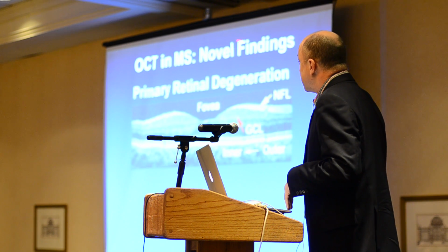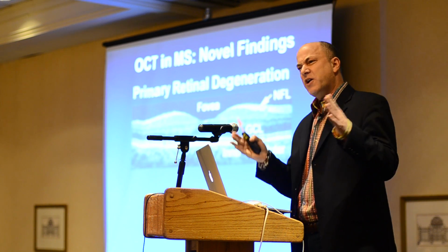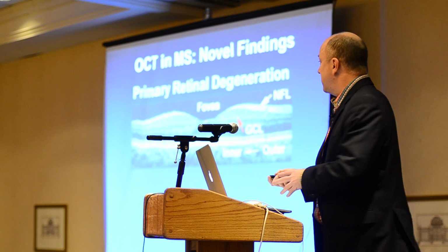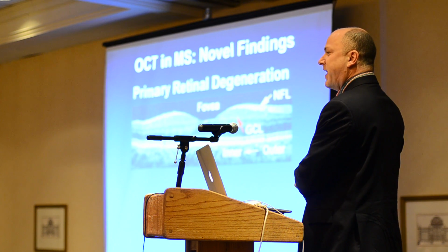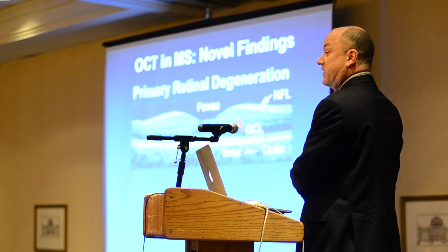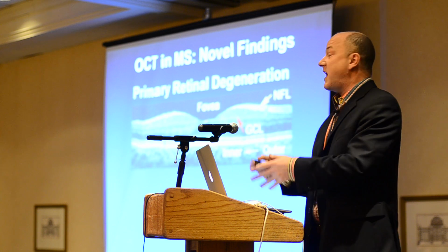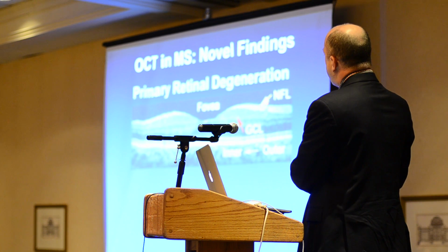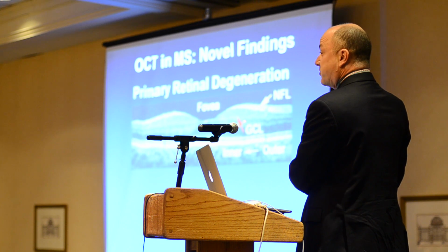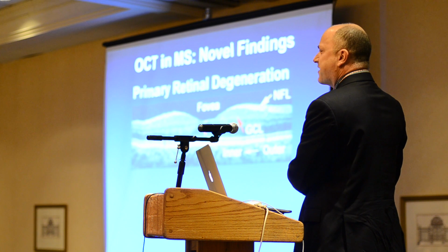The other thing that we've seen in OCT is retinal degeneration. So again, looking off the optic nerve at the retina, this is the normal macula, the sharpest area of vision you have in the retina. This is the fovea. This is where you're trying to drive your visual focus at any one time, because in the fovea, as you notice here, the nerve fiber layer, the nerve cells that produce the nerve fiber layer, the ganglion cells, all those other cells are pushed out of the way.